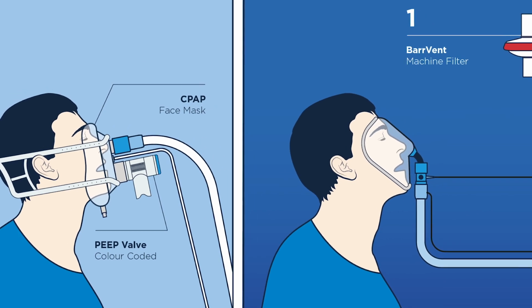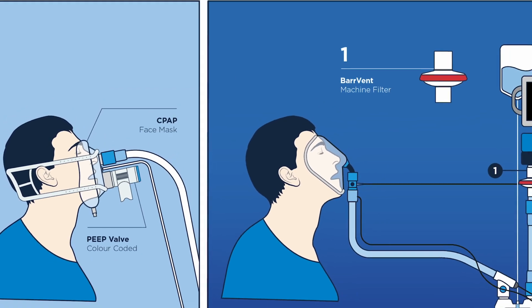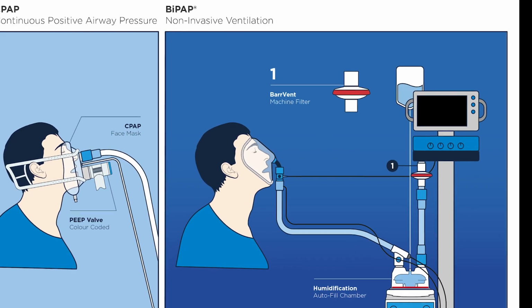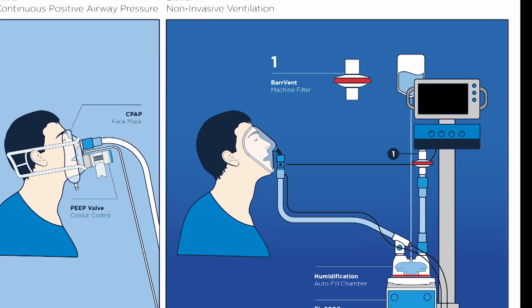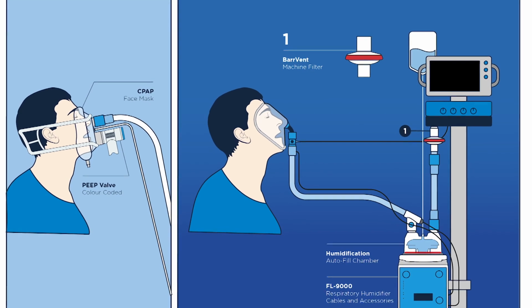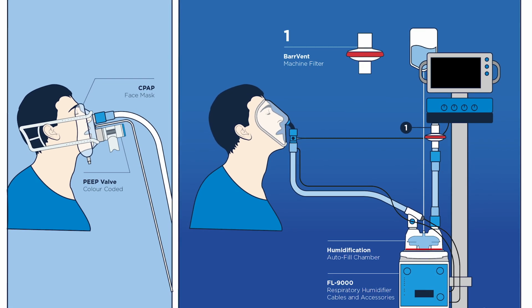Non-invasive ventilation cannot and does not replace invasive ventilation, but evidence shows that non-invasive ventilation can be used in many situations to decrease patients' dyspnea and work of breathing, improve gas exchange, and ultimately avoid the need for intratracheal intubation.